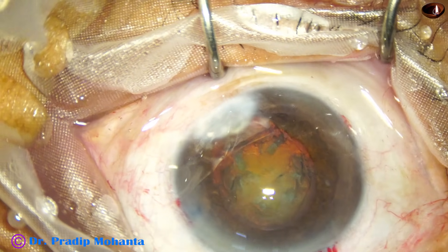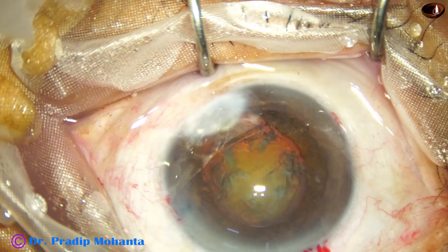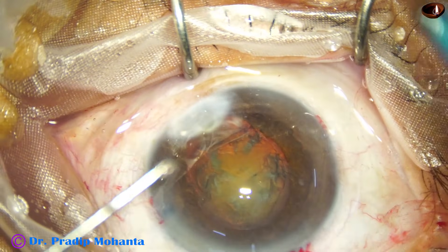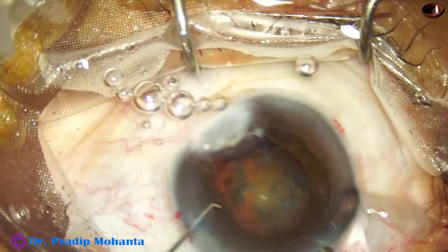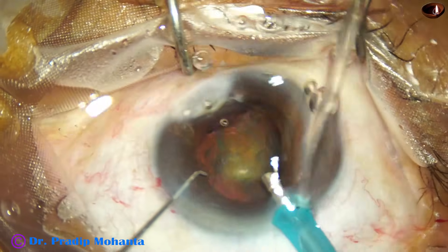The main wound is enlarged a little bit to about 3 millimeters. And now I am going to employ my technique — the submarine chop technique.